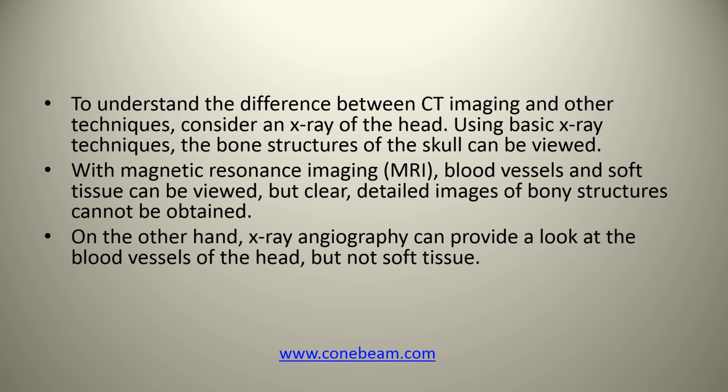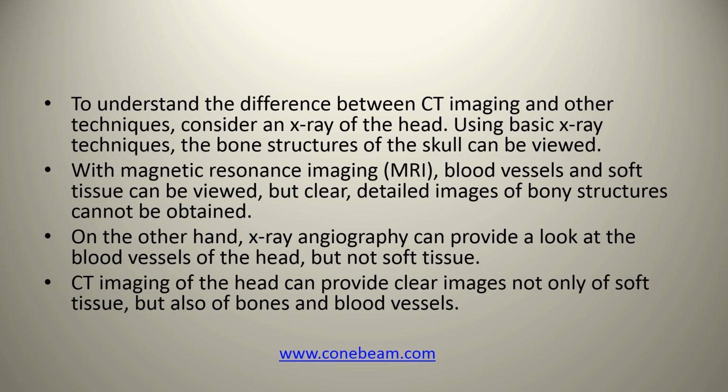And the reason we point this out is that MRI has an ability to gain an image of the head and neck without any radiation dose, because you're using magnets, as opposed to using X-rays. On the other hand, X-ray angiography can provide a look at blood vessels of the head, but not the soft tissue. CT imaging of the head can provide clear images not only of soft tissue, but also of bones and blood vessels. And this has to do a lot with progressions that have been made in CT scanning software and CT scanning equipment.